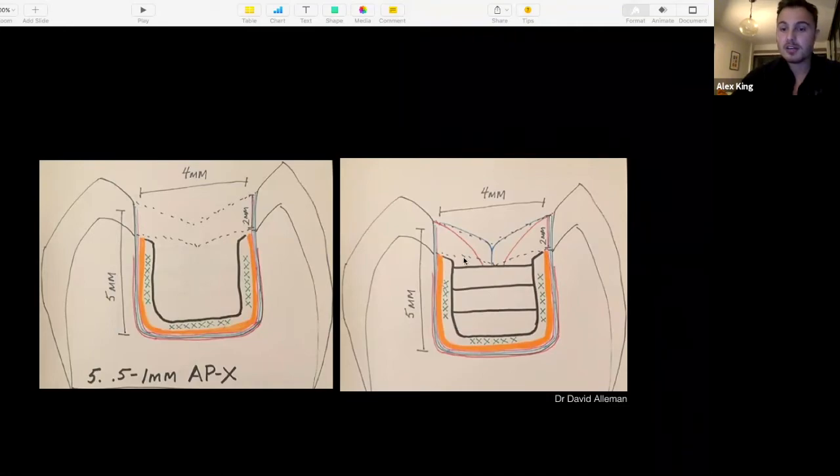And then here, okay, on top of our dentine, when we've only bonded to dentine, we've followed the hierarchy of bondability. We've decoupled our dentine bonds with time by only bonding to dentine in these first 5 minutes. And if this is deep here, we do this dentine and wait another. Then we bond to our enamel, because the enamel would have otherwise sucked or pulled the restoration away from the hybrid layer. And then we do our enamel last 2 layers at the end.